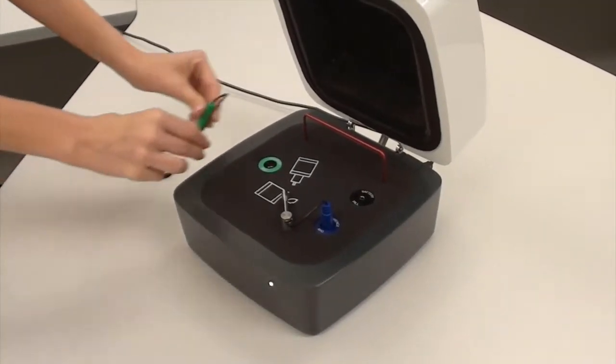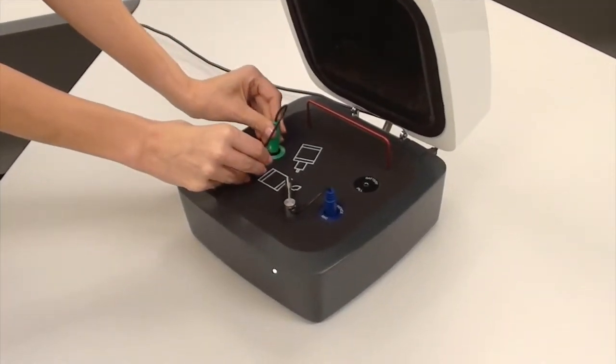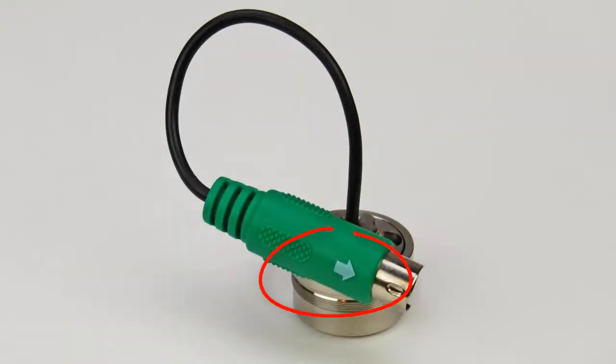First, carefully install the coupler microphone. The white arrow should be facing the front of the box.